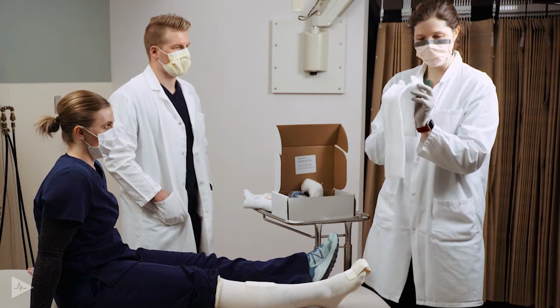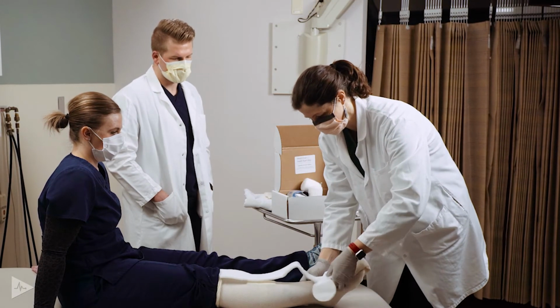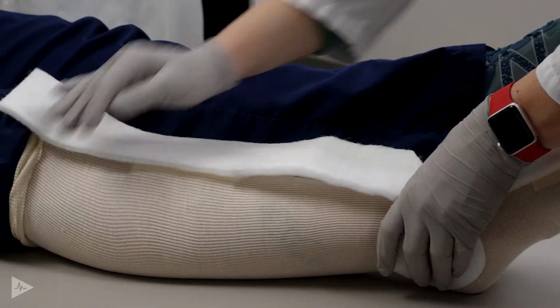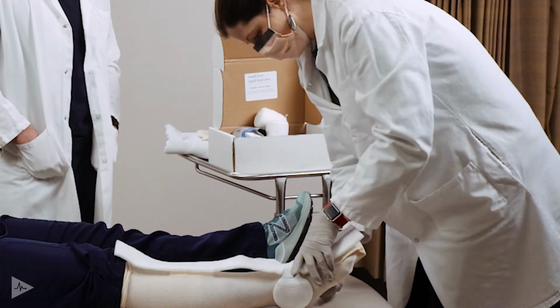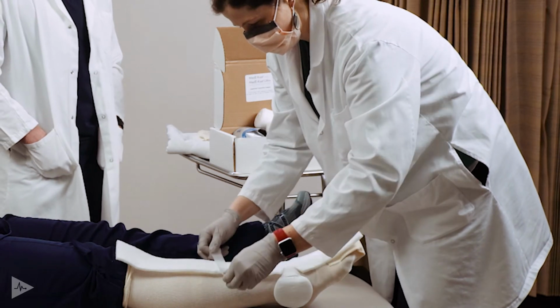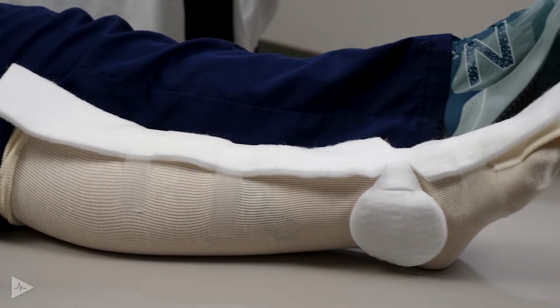In the bottom of the kit, you then have the protective padding layer that will go over the forefoot, and then the 2 malleolar pads for protection of the ankles, and that extends up the leg. I always try to place that over the malleolar prominences first, and then you will tape that in place. One over the dorsal foot, and I'll do 1 to 2 over the shin area, and then we want to secure the malleolar pads as well.